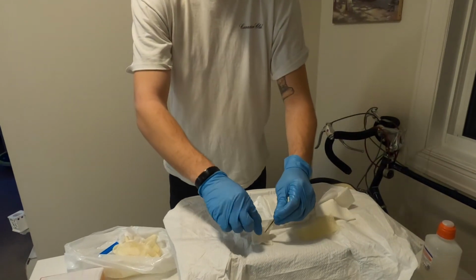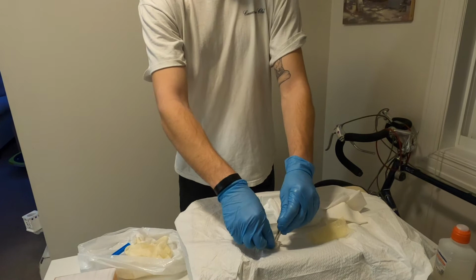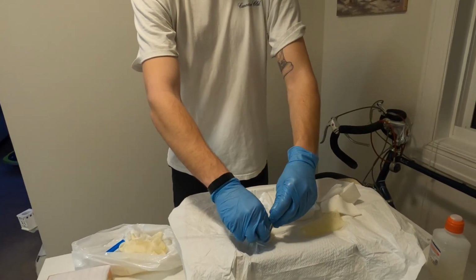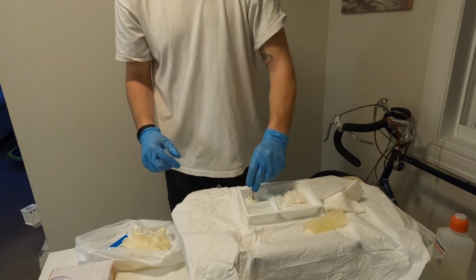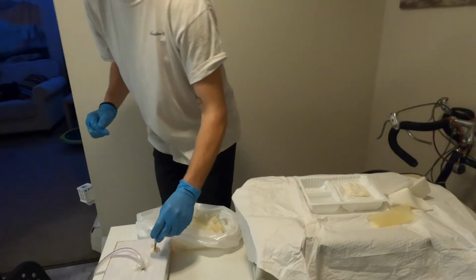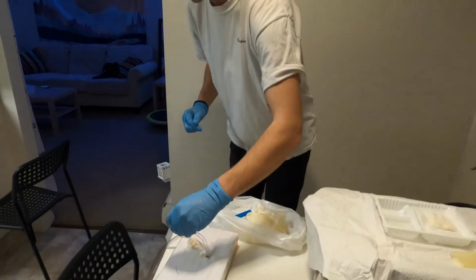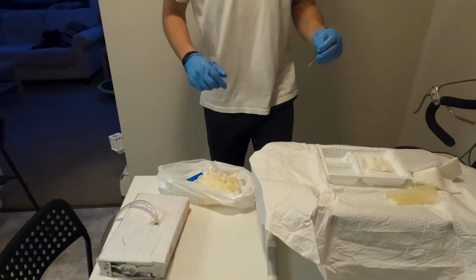And again, not trying to lean my face over the dressing tray here. And one last swipe around the peri wound here. Again, making sure not to touch the sterile forceps to the peri wound.